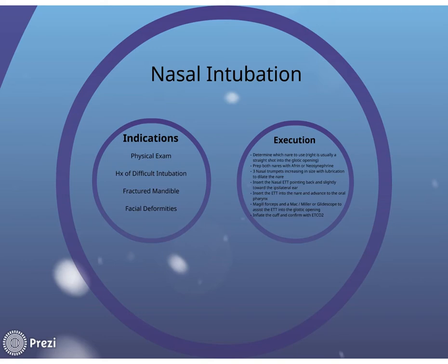They kind of have an angle. And sometimes people, when they're starting, will grab them and you'll have them going up. You don't want them going up, you want them facing down. Point to remember. It's a little embarrassing, you did it the wrong way. And so you do your DL. You've already dilated this. They're ready to be intubated.